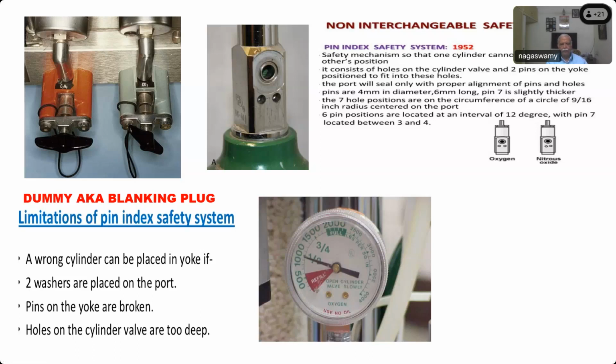What is this? Bourdon gauge. This is a Bourdon pressure gauge. Very good. What are the safety features in this? Anteriorly, it is covered by tough glass on the anterior side. If the pressure increases, it ruptures only posteriorly. Okay. There are so many safety things which you have to say. That's only one of them that you are saying.